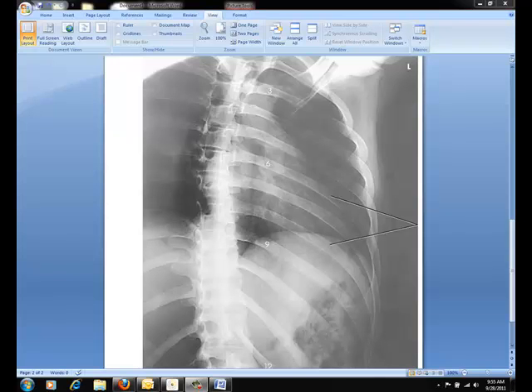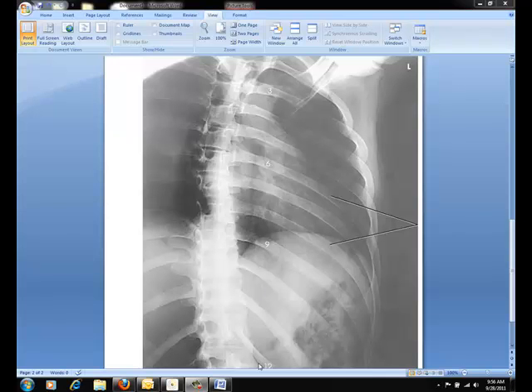One thing to note about this particular image is it shows the importance of getting the rib attachment with the vertebral column. Unfortunately, we do not see the completion of all of rib 1, nor do we see all of rib 12. This person took an image right in the center of being above and below — a happy medium where the region of interest was right here. However, typically if you're doing an upper, it should include all of ribs 1 through 10, and lower should be 8 through 12. So this image isn't typically something we'd be fond of.